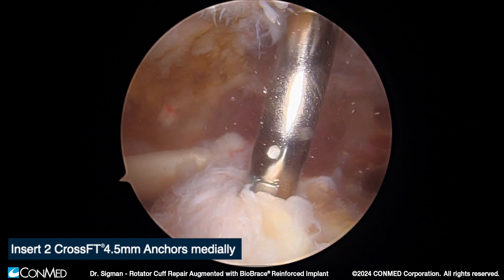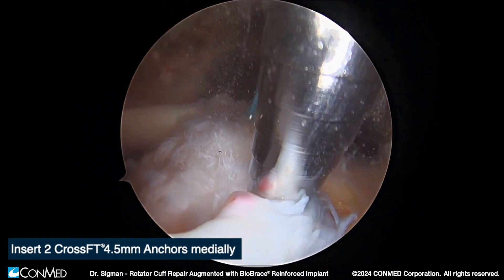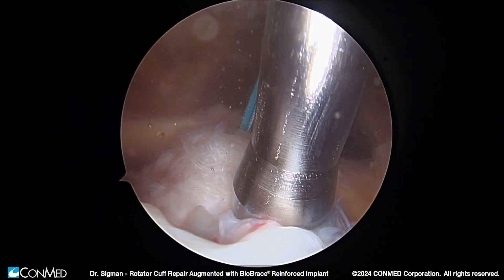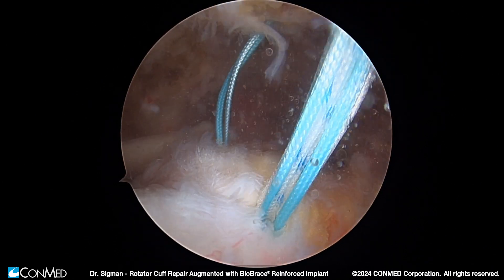We're going to pass one anterior along the medial footprint and one posterior along the medial footprint as well. We'll typically only leave one suture in each anchor, although certainly additional sutures can be passed as desired.